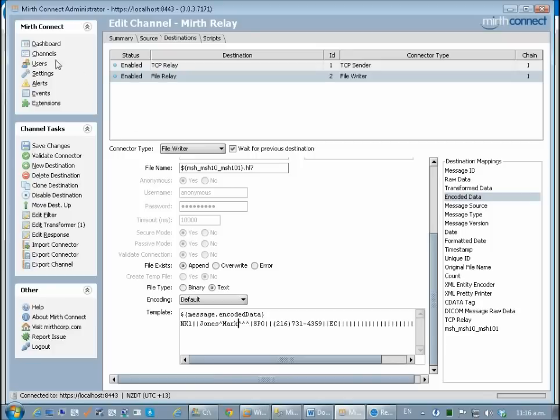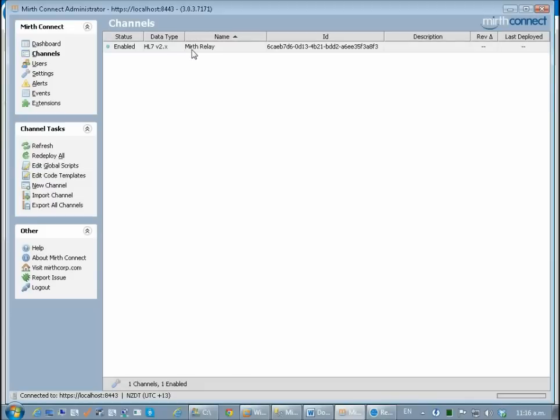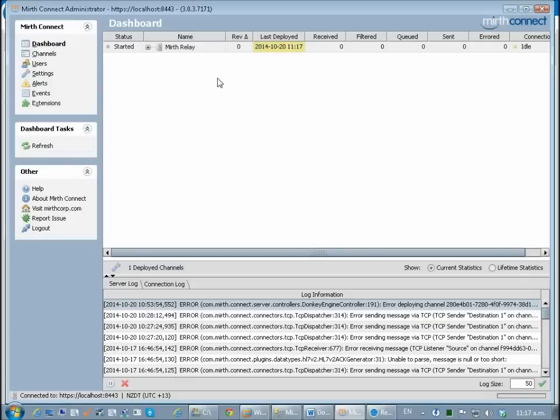I'm just going to save that and come back into here and deploy the channel. I've checked that it has gone into the started status.